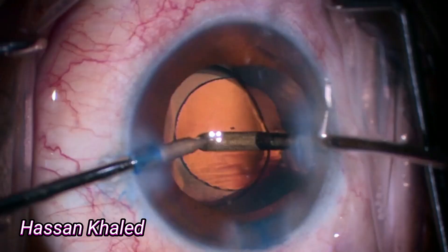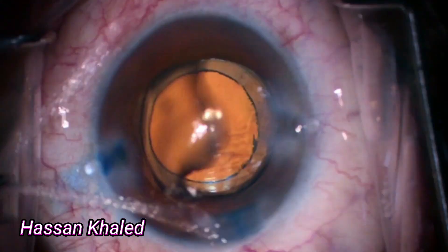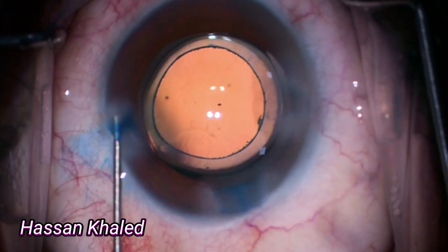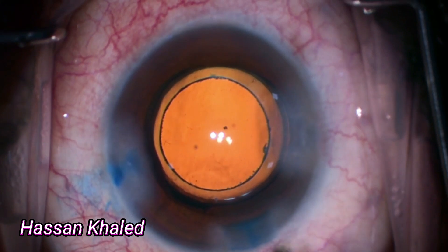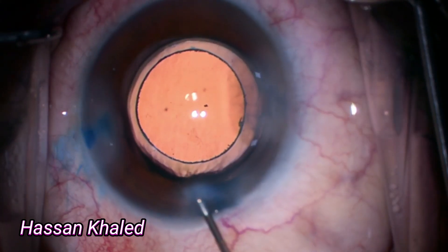Look at the beautiful 360° overlapping of the capsulorrhexis with the optic edge. Then stromal hydration as usual for the paracentesis and the main phaco incision. Let's watch the second case.